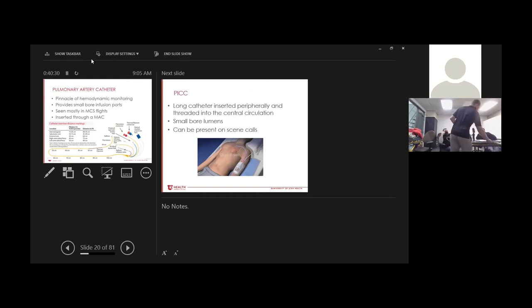Your opportunity. This is great. They come in and you get in there. It's a mess. This is a really nice one; I borrowed this from CVICU, and it's really helpful. So if we trace this line, we've got our sheath. It goes into, ideally, the SVC.